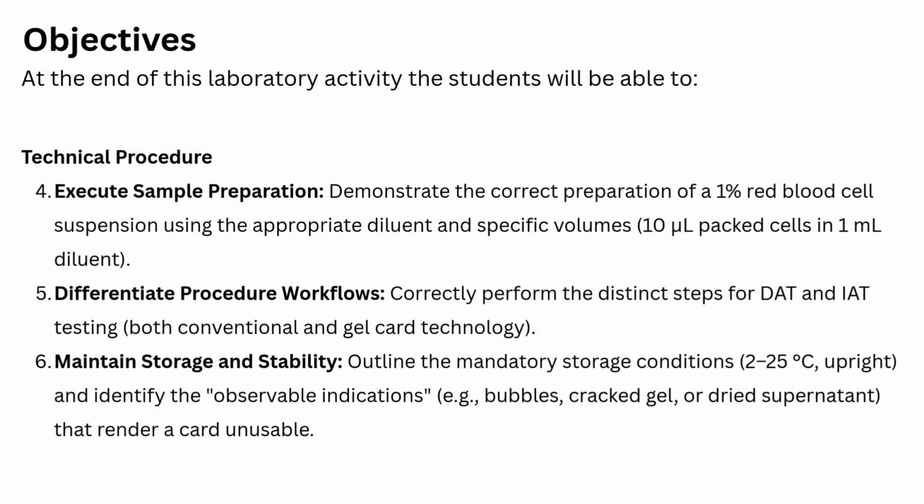And then differentiate procedure workflow. So correctly perform the distinct steps for DAT and IAT testing, both using the conventional or manual method and that of the gel card technology, or CAT.